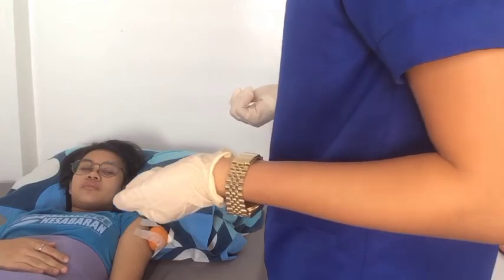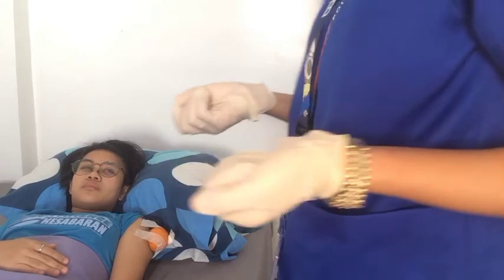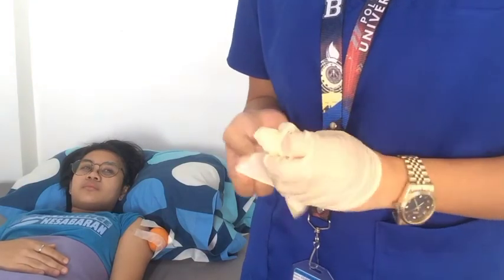I now go record and report, wash my hands, and clean the area in order to lessen the contamination in this area. And that would be all for the administering of intramuscular injection.